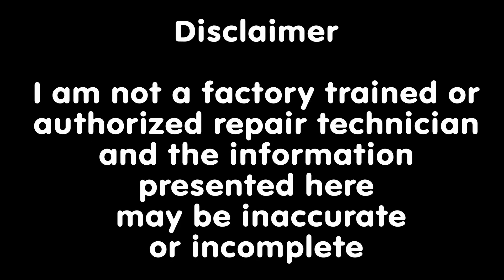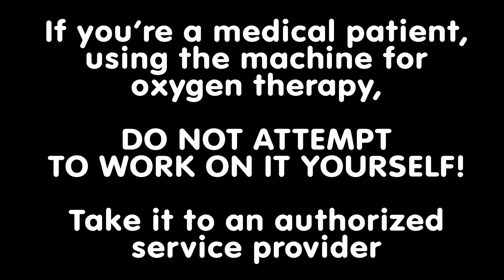Before I start, since it was originally sold as a medical device, I think I need to make a disclaimer. I am not a factory trained or authorized repair technician, and the information presented here may be inaccurate or incomplete. If you're a medical patient using the machine for oxygen therapy, do not attempt to work on it yourself. Take it to an authorized service provider. This video is intended for glass workers with proper tools and mechanical skills who accept all of the risks of damaging the machine and possibly injuring themselves.